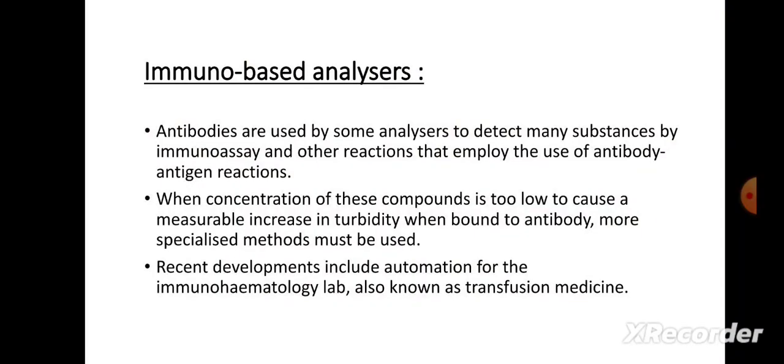Next is immuno-based analysis. Antibodies are used by some analyzers to detect many substances by immunoassay and other reactions that employ the use of antibody-antigen reactions. In auto analysis, we use samples and reagents. In immuno-based analysis, we use antibodies. That's the main point in immuno-based analysis.